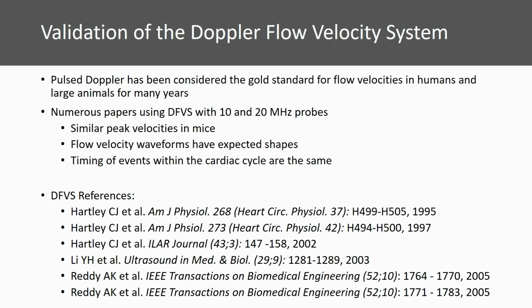And our second paper in 1997 validated the measurement of pulse wave velocity. We used a simultaneous tonometric pressure to validate these measurements as well. Then over the years, we have followed up with several different applications. A few of them are shown here.